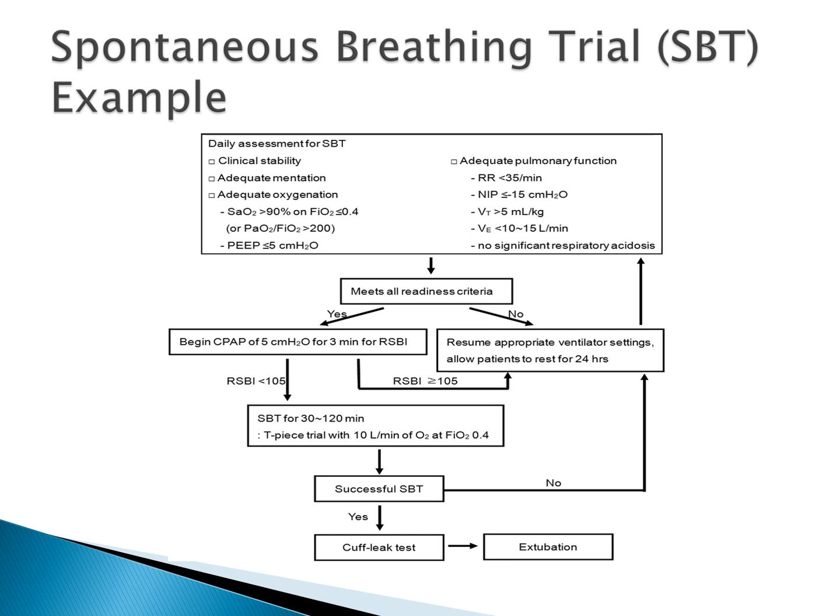Now it's a scale, so I would say 75 is probably better than 95 for most of our patients, unless what's causing the 95 or the 105 is agitation or pain. So you need to obviously stabilize them for that as well. And then you're continuing, as I said, the standard of care is still pretty much 30 to 120 minutes, although some of the more recent data are saying that you're going to know in the first 30 to 60 minutes whether or not they're going to do well.